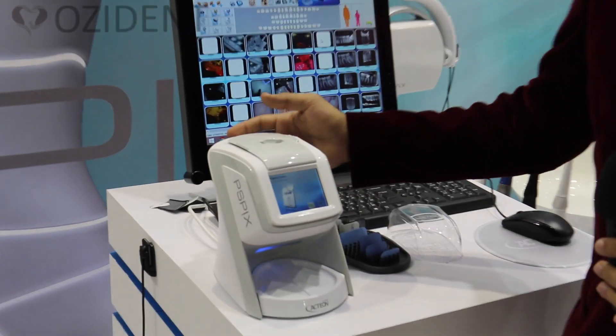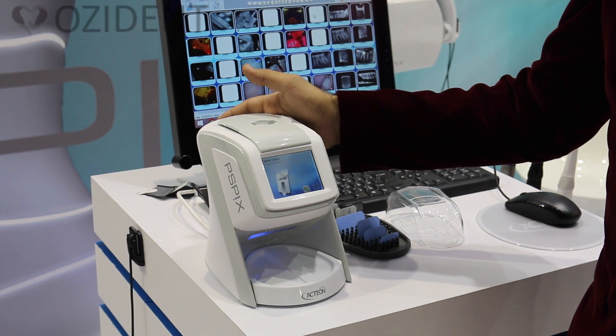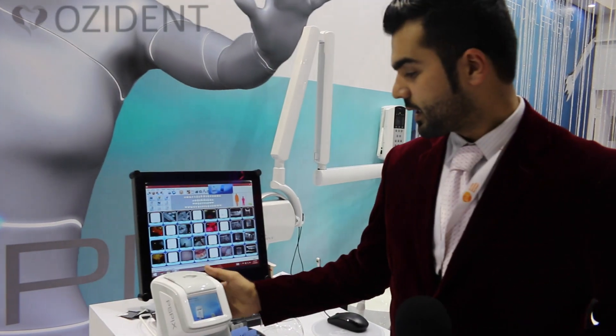As you can see here, this is the new PSPIX machine. It is the smallest machine you can find in the market until now, and one of the fastest and most reliable ones, and the look is good as well.